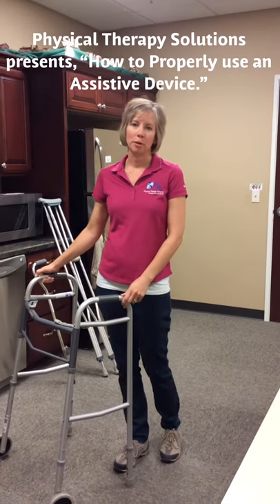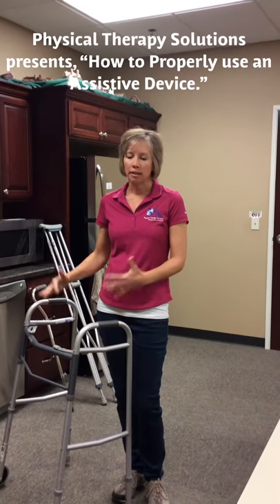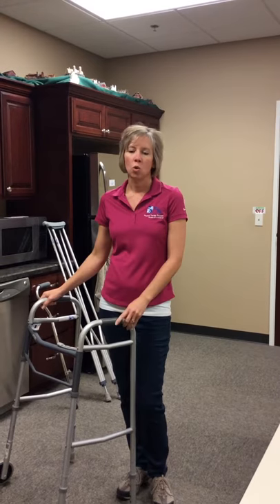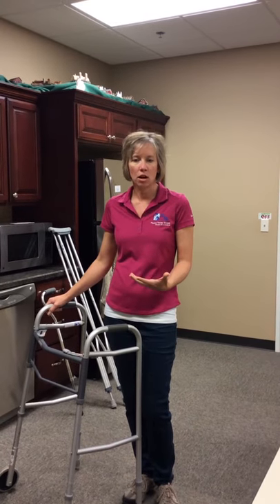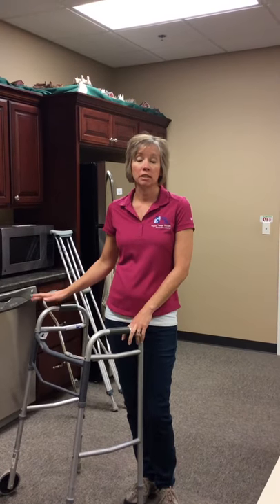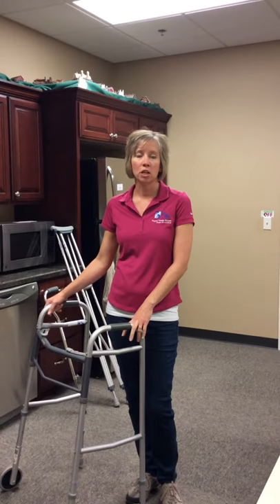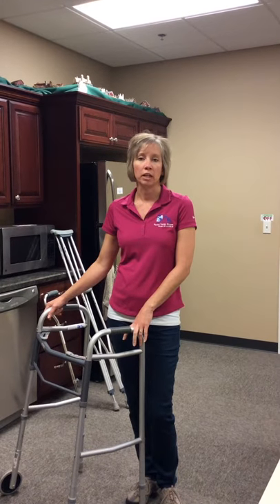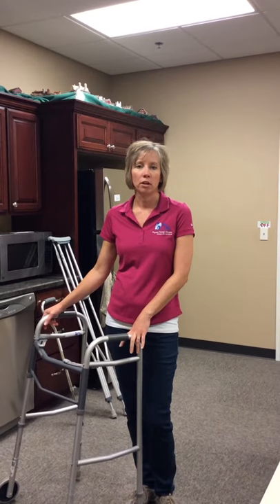Hi, I'm Shelly Deitmeyer with Physical Therapy Solutions. At some point, maybe we might need a little assistance, whether that be from an injury, our balance getting a little off, or even after surgery. We might need a little help from an assistive device such as a walker, cane, or crutches. I'm going to talk about the differences between them and how to get a good fit so they can help you to the best of their ability.